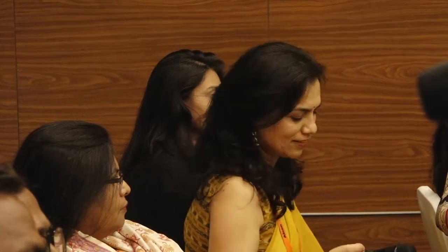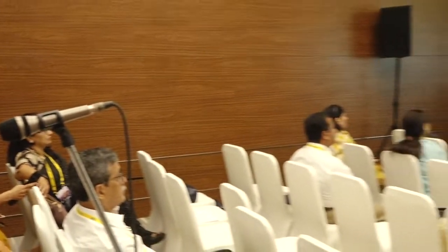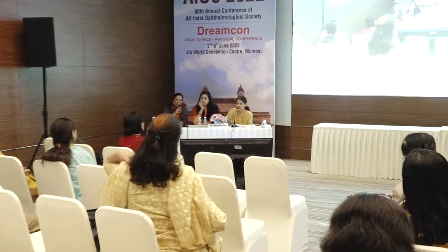I don't think it is compulsory to do imaging. If you can identify on gonioscopy the sine wave sign, it is a sign that some plateau iris is there. The question is, should we do the PI or not? That is another question that I have put up here. The PI is to relieve the pupillary block element that the patient has, so we have to do PI. It is not for the opening up of the angle.